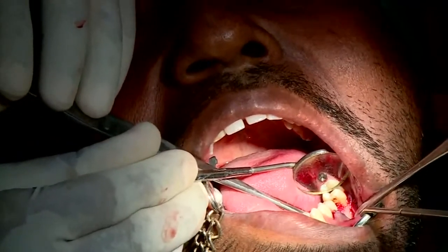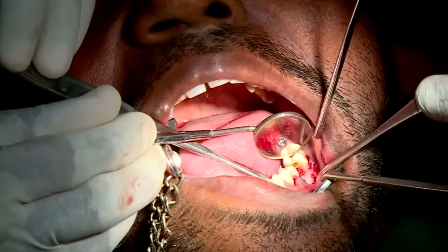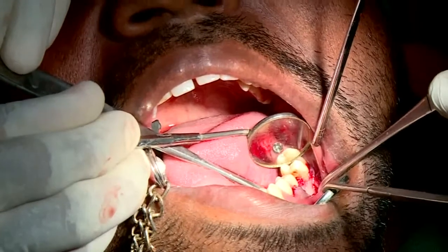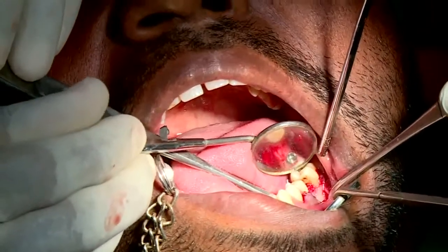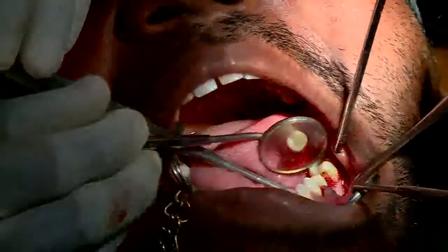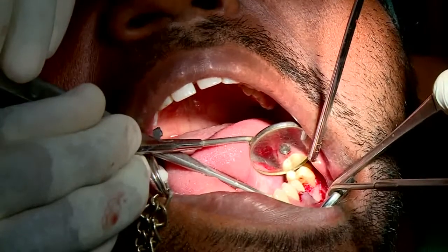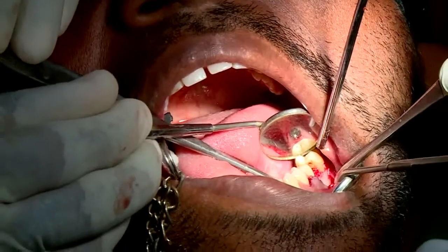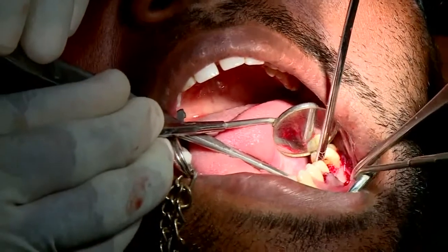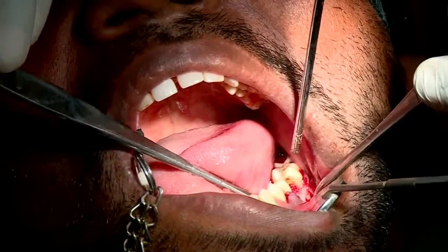I still have to drive about 1.5 to 2 millimeter of my implant inside to make it flush with the crestal bone. Now, in an ideal world, I would have preferred to go to 4.2, but to be perfectly honest, that's the amount of bone I have. I am placing an implant now, 3.75 by 11.5, for a single tooth. I think it's still okay. It's not ideal, but I would definitely not place a 3 or a 2.75. I wouldn't go for a very narrow one.